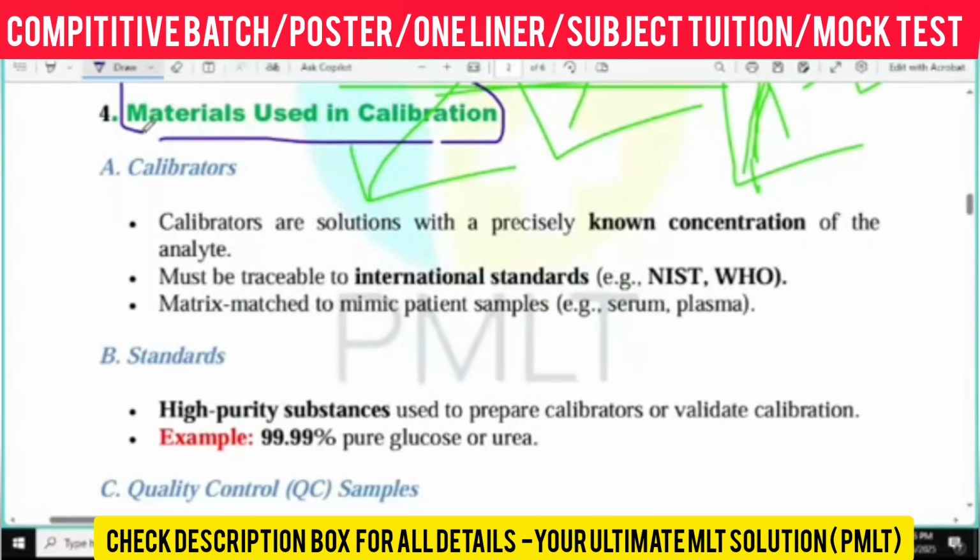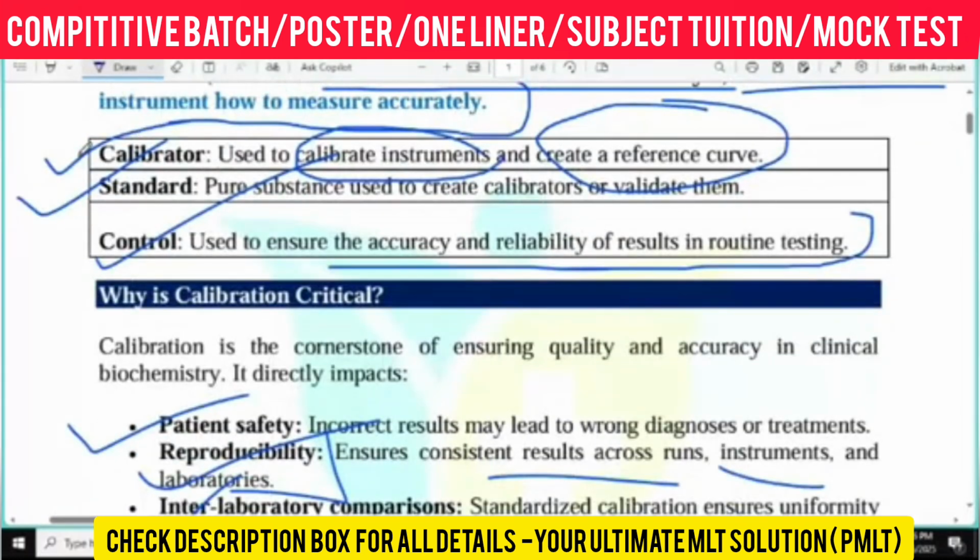I have already mentioned that you have to use a calibrator, a standard, and a control or quality control. So we might use three types of things for a calibration. That should be calibrator, that should be standard, and that should be control.